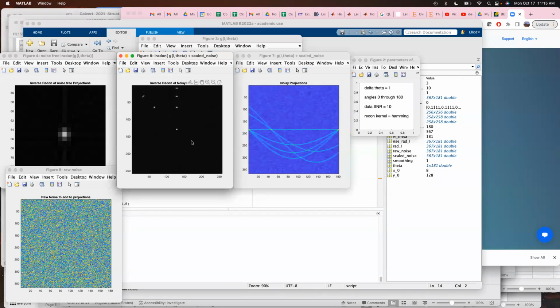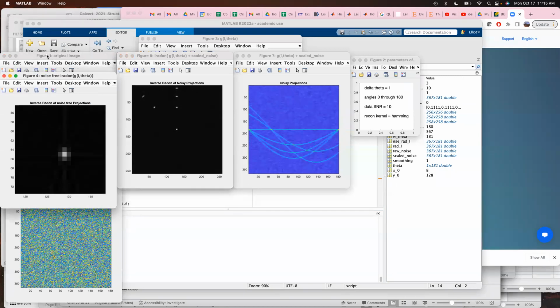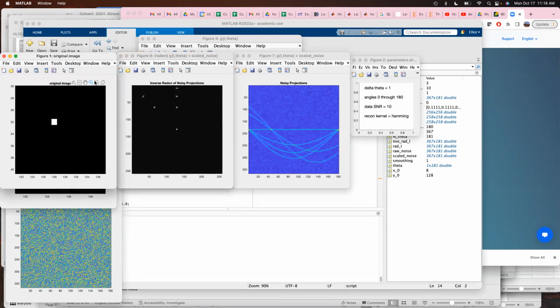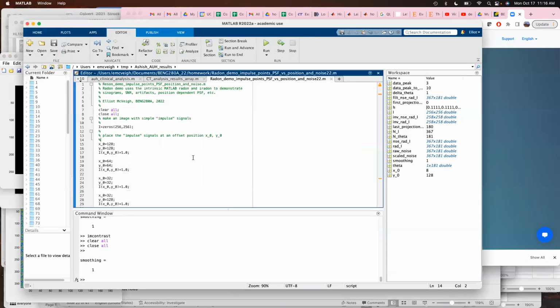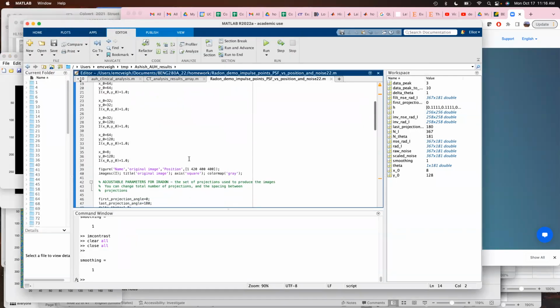So we're going to see some noise. So now remember what our first image, this was our starting image here. Oh, here, like these little dots, and this is what we get from this simulation. And what causes this blurring and change in signal to noise, etc., you can sort of discover through iterative running of this function. So we can go down here.